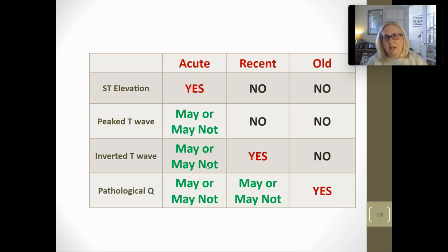It's now Tuesday, so I thought I'd come and get myself checked out. I hook him up to the EKG and I see he has inverted T waves all over the place. That means he had a heart attack on Saturday while mowing the lawn. Luckily, it was a mild heart attack, and he was able to make it to the hospital to get checked out. Okay, and they'll do further testing from there.